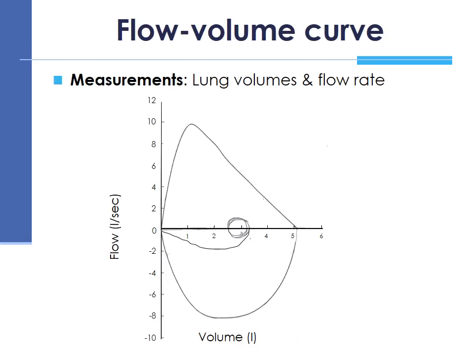After adequately performing maneuver 1, the flow volume curve that is obtained looks like this. Remember that the measurements that are taken by the flow volume curve include both lung volumes as well as flow rate. So flow rate tells us that speed is a factor. The rate or the speed at which the airflow is taking place is an important factor during this lung function test.